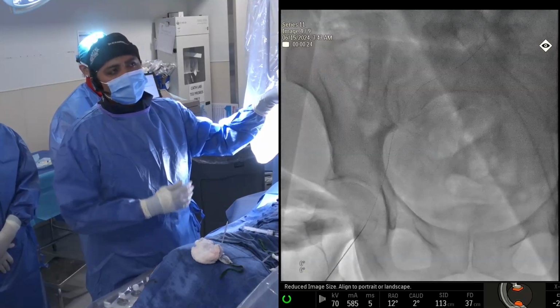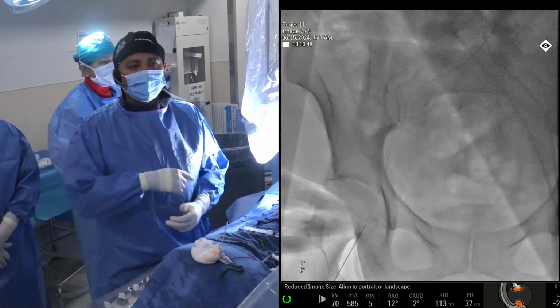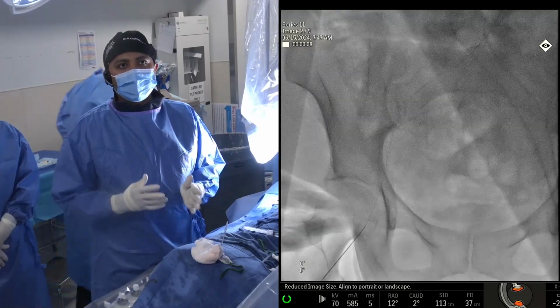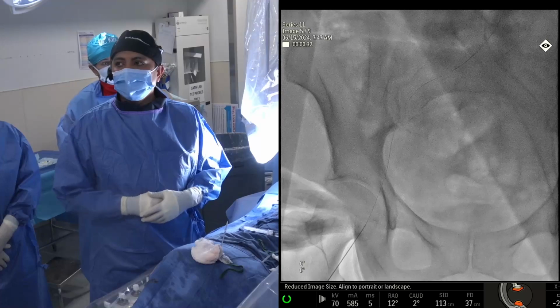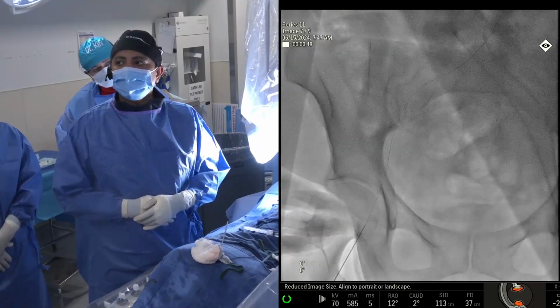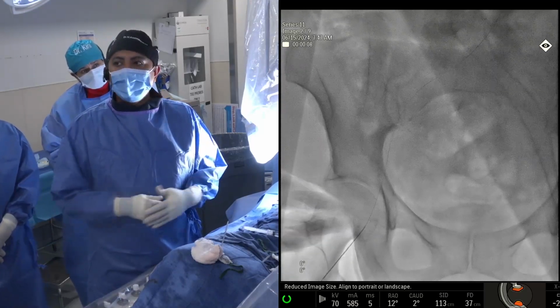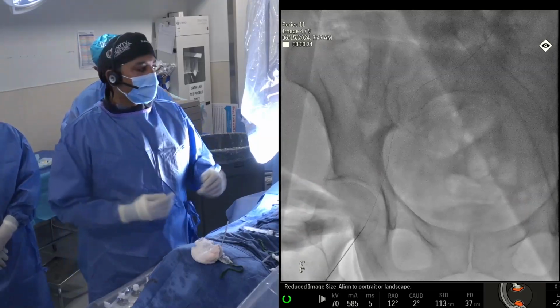And then we usually do up and over with the bailout 018 wire across from the contralateral side, but we avoided this because of two reasons. The amount of calcium or the hostileness of the main access side was not there, so we were comfortable using just 2 Preclose and maybe an Angio-Seal on the way out if we still needed to bail out. And also it is more problematic in this person, especially with the dissections. So that's why we didn't do an up and over access across the aortic bifurcation to the other side.